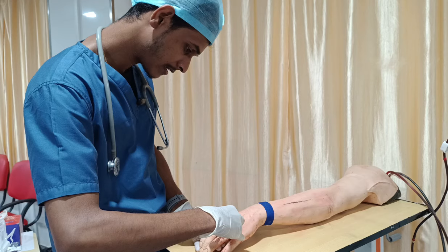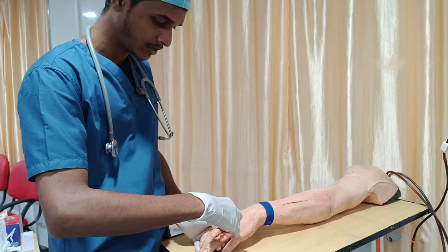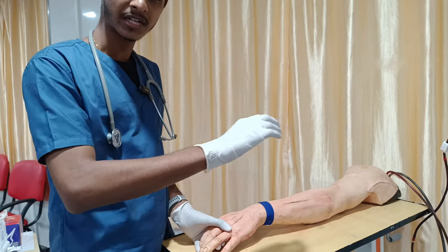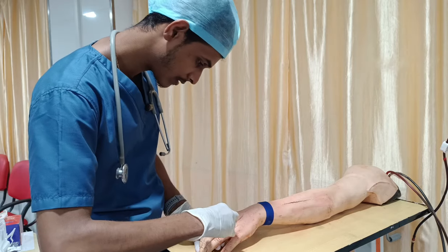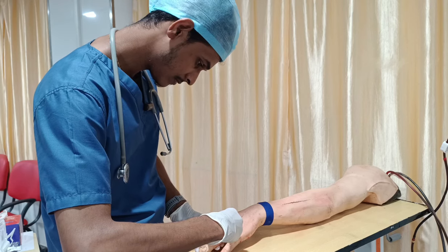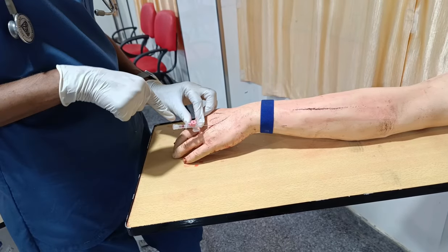Once you prick that area, you will get a flashback in this flashback chamber. Once you get the flashback, you have to reduce the angle and then advance the catheter further. First I prick at a 30 degree angle. Here you can see I got the flashback, with some blood tinging in the chamber.